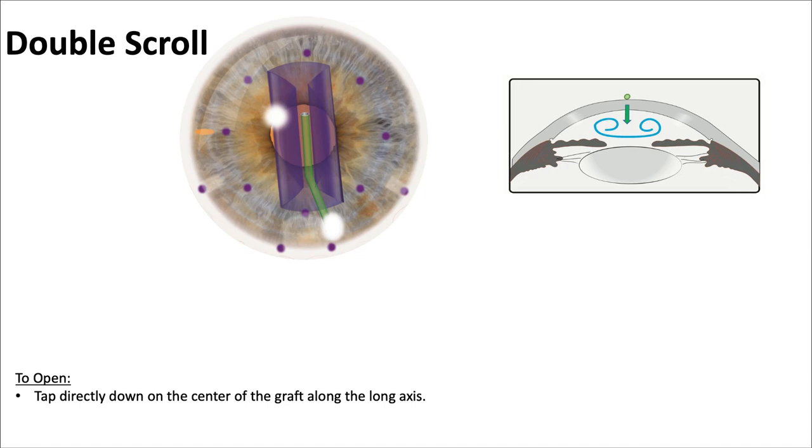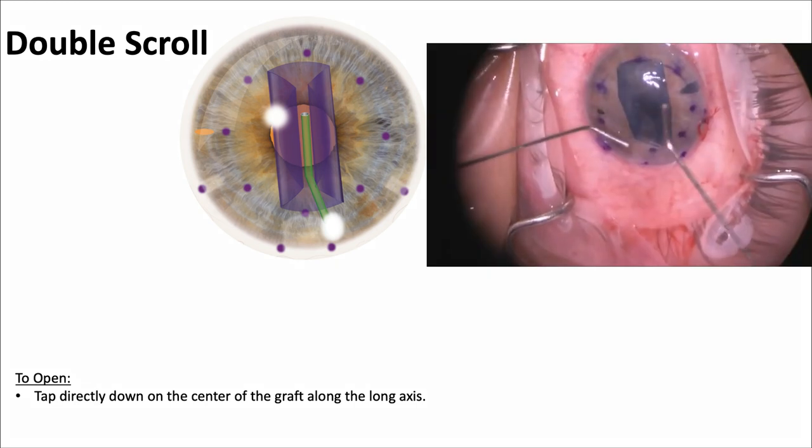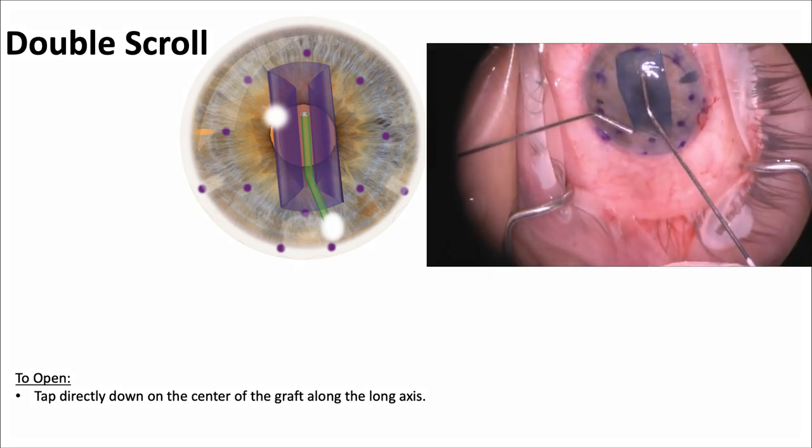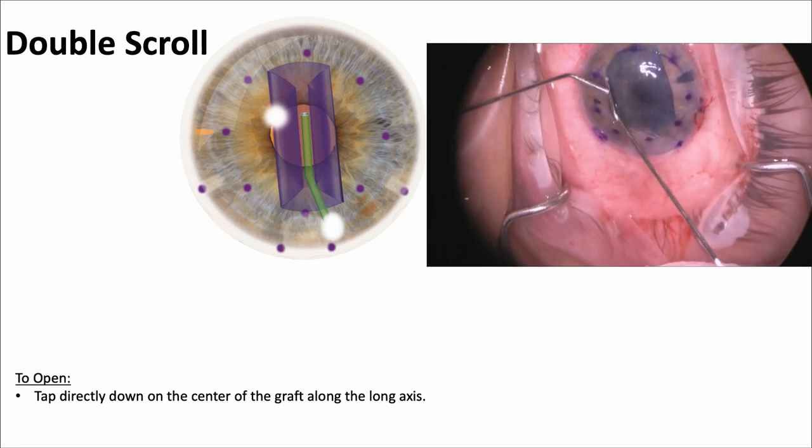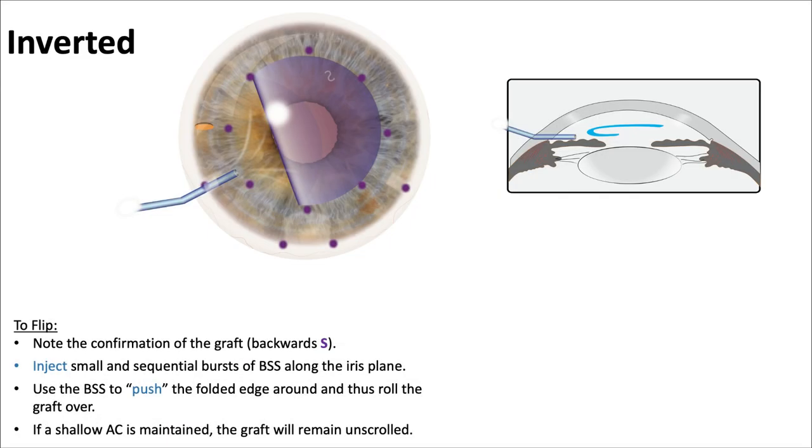The double scroll — all you have to do is tap down right on the center. That'll send fluid waves along both sides and open up both scrolls. Tapping here right in the center sends the fluid waves to the sides, and it opens right up. That's really revolutionary.